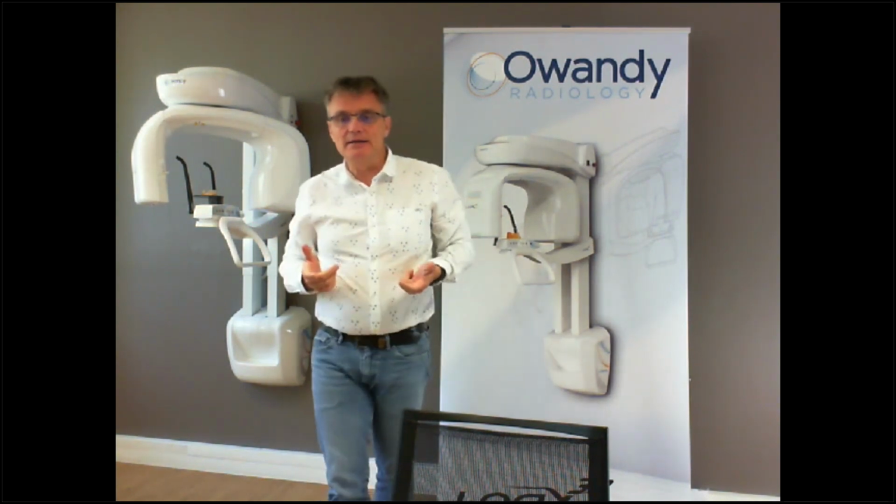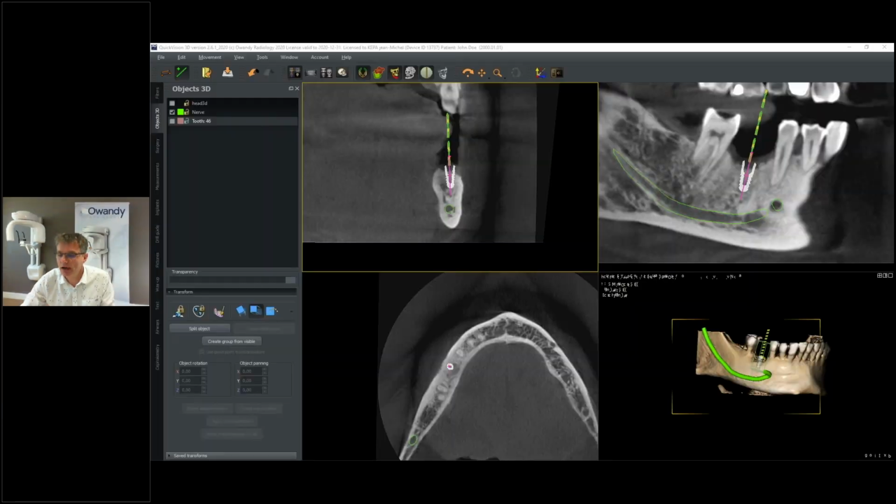We select the correct program, exam from the device, and we emit X-ray. And then we retrieve the STL file. Now I will call my STL file from the CBCT. I will show you again the software.